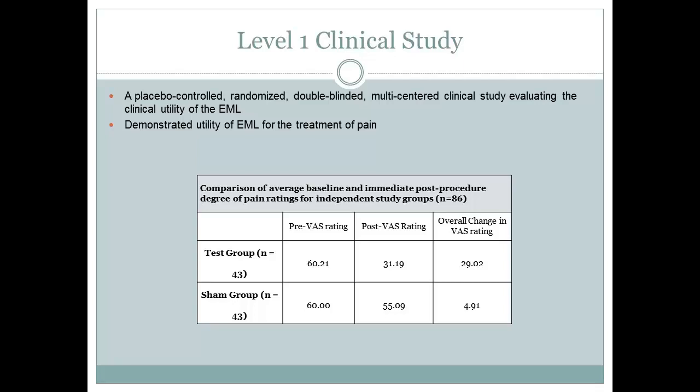So this is great evidence, very strong evidence that a patient blinded of the treatment protocol when receiving real laser shows a dramatic improvement in their overall severity score regarding pain.